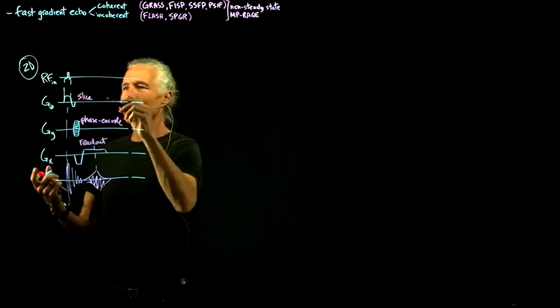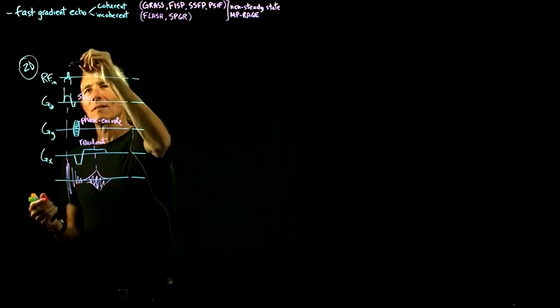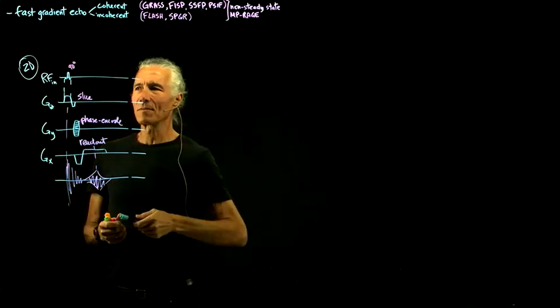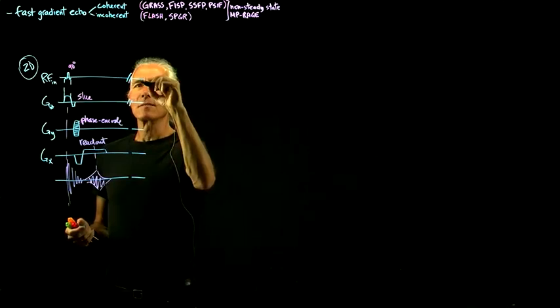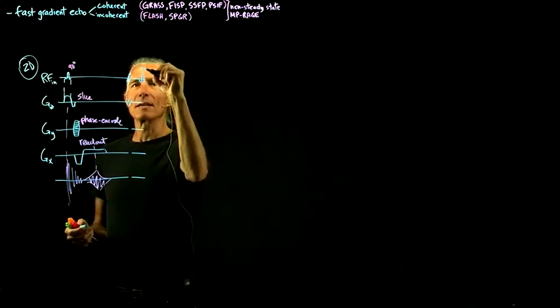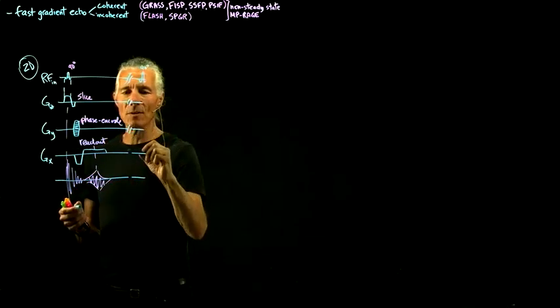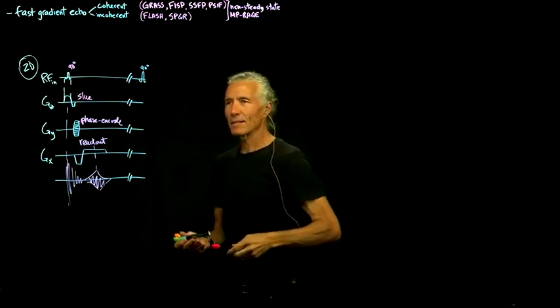For instance, if we did a 90 over here, it's going to take a couple seconds for that to recover. So we wait a long time and then do another 90. You can still do this. There are certain reasons you might want to do this. This sequence is still on the scanner.